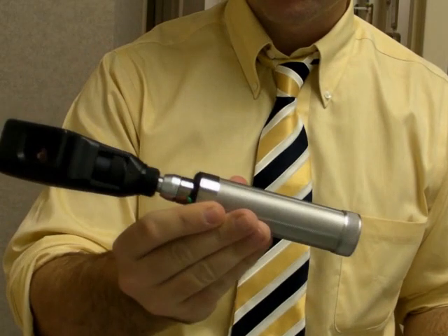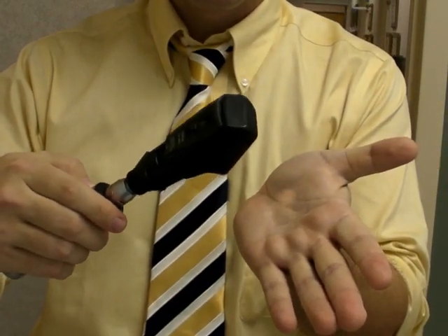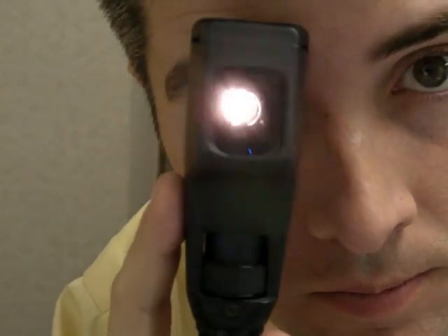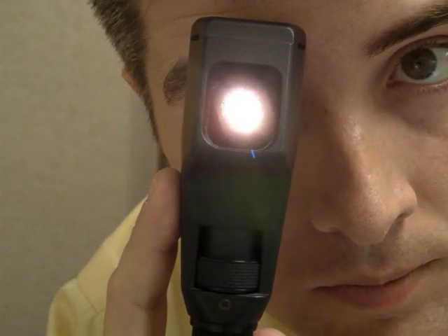This is the machine we use — it's called a retinoscope. A retinoscope is basically just a light with a little beam splitter inside of it. You look through it and shine this light in your patient's eyes, and you look at the red reflex and how that red reflex moves in order to get an idea of what the prescription is.